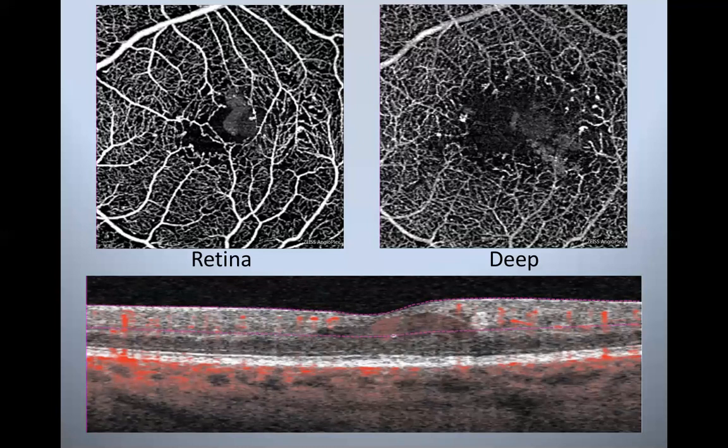If you look at the deep retinal plexus, that layer of vascularity under the superficial on the right-hand side, you can really see there's evidence of these microaneurysmal changes, and there's a much larger area of impaired perfusion than there is on the superficial vasculature too. So it's another reason to really look at that deep retinal plexus. Sometimes it can actually be a lot more affected than the superficial vasculature.